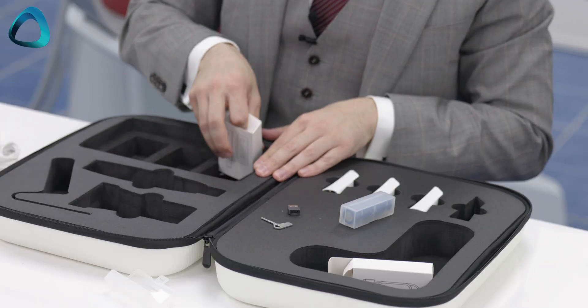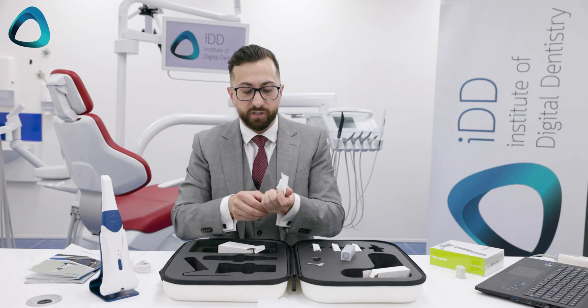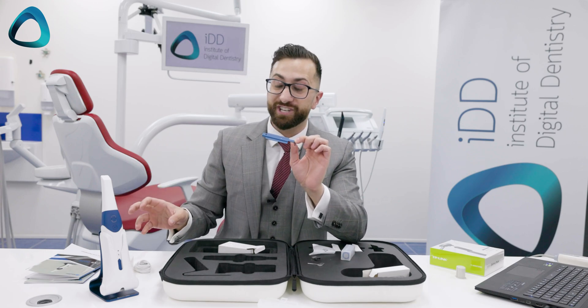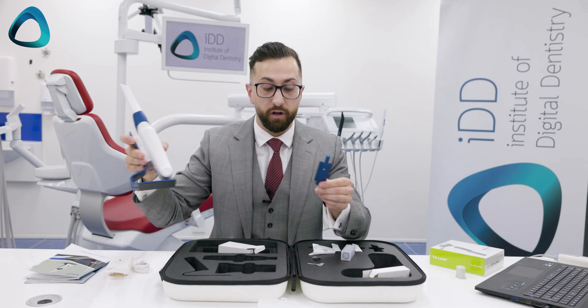The last thing in the box with the Alliedstar 200E is a wall mount. They give you a couple of screws and a wall mount that matches the docking color, which can be used to mount the docking station onto a wall if you wish.